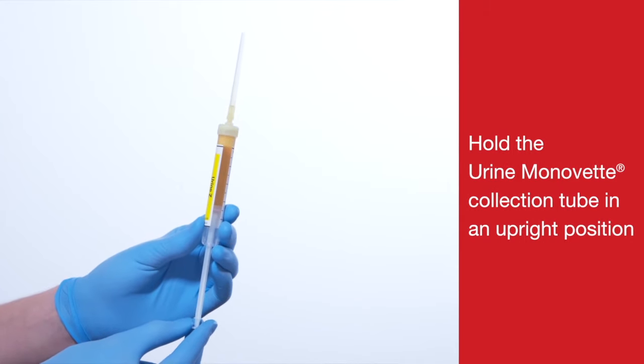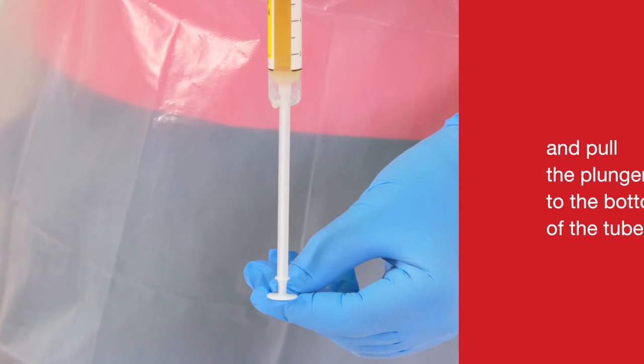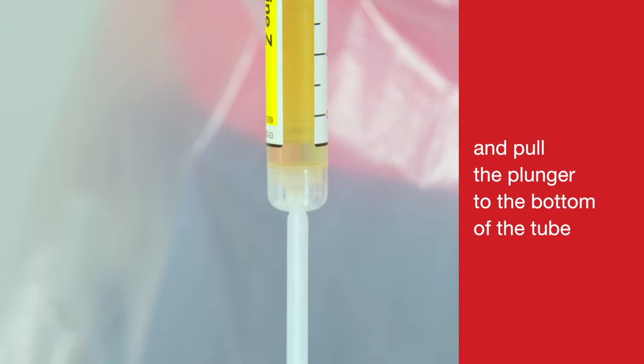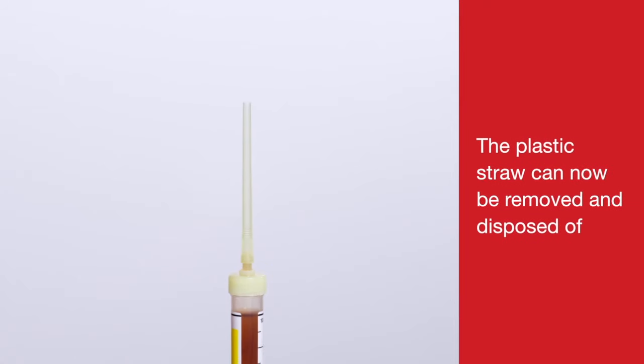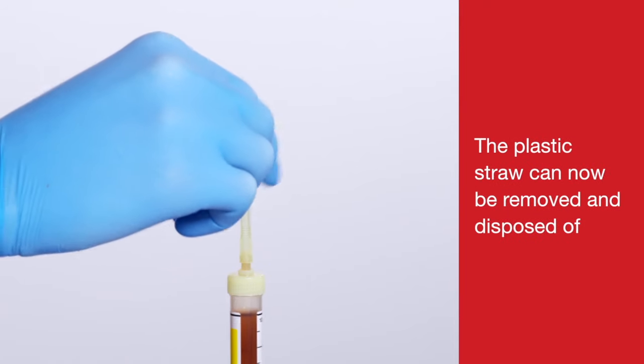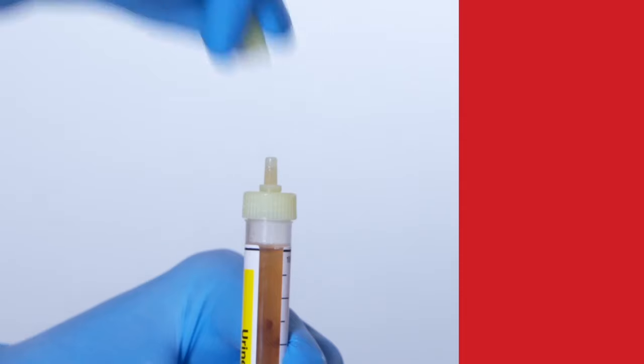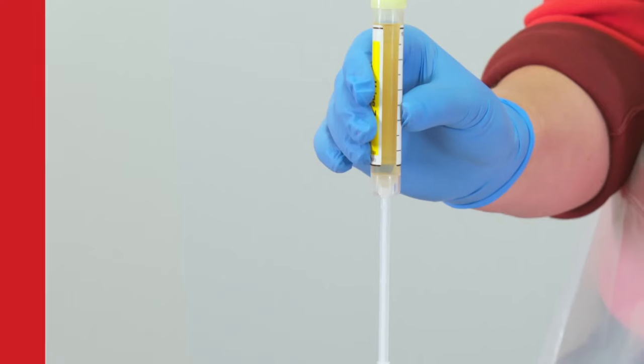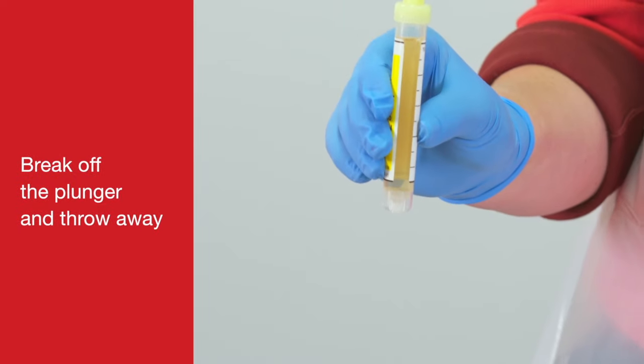Hold the Urine Monovette collection tube in an upright position and pull the plunger to the bottom of the tube. The plastic straw can now be removed and disposed of. Replace the stopper. Break off the plunger and throw away.